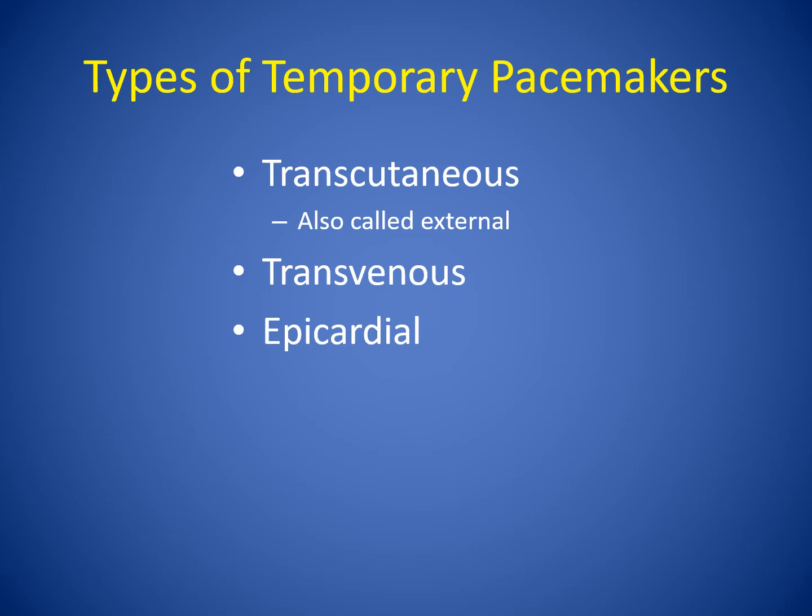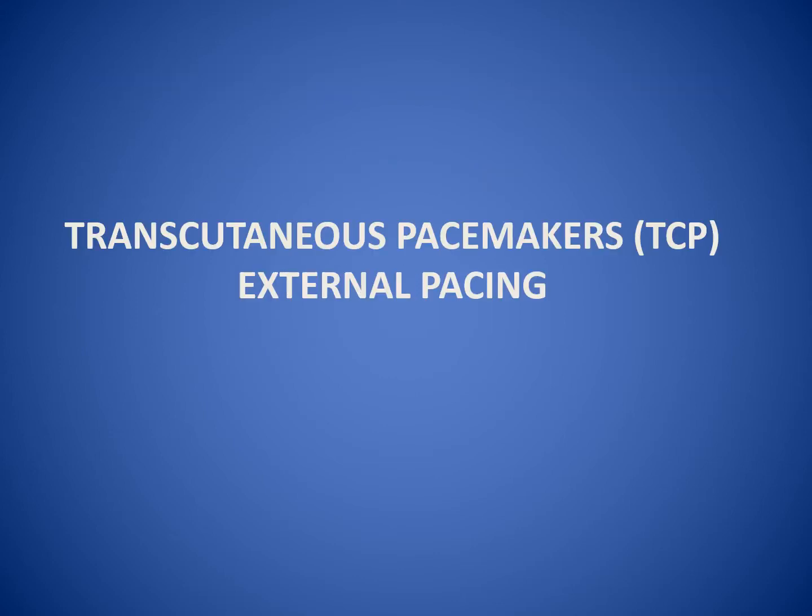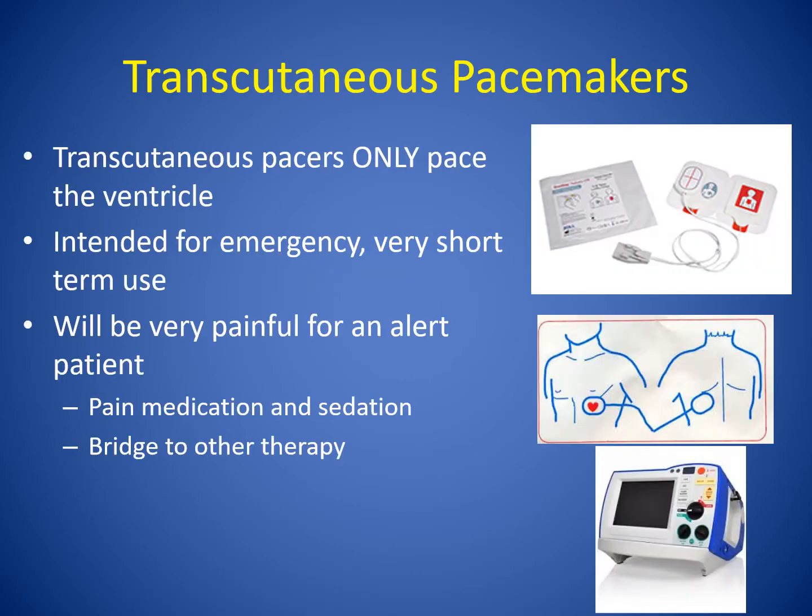We're going to talk about each of these. First, temporary pacemakers, the different types. You have transcutaneous, which we will also refer to as external, transvenous, and epicardial. First, let's talk about transcutaneous pacemakers, or external pacers.